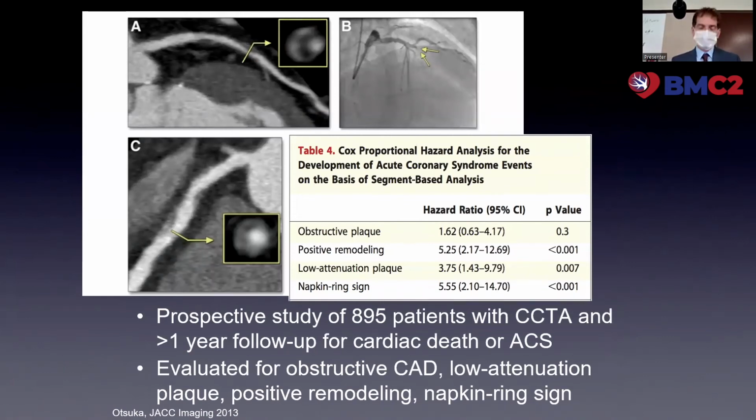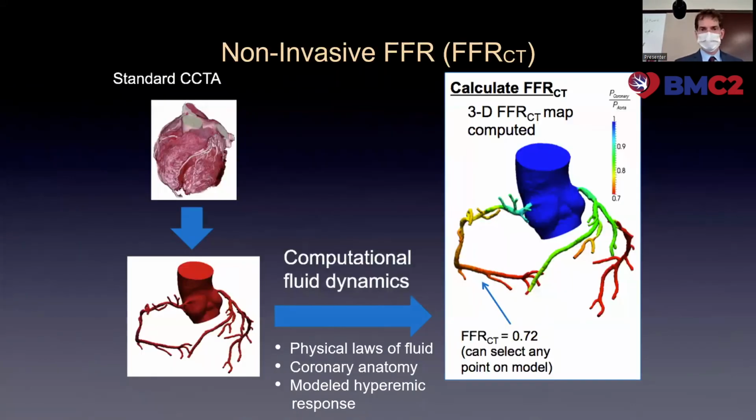So now I want to just move on and talk about some other areas, and I just have a couple slides left. I want to talk about a few areas that are of interest, future directions of coronary CT. There's a lot of interest in looking at high-risk plaque features, people that might, if we see something on CT, represent a future acute coronary syndrome or something that could lead to plaque rupture and MI or death. There are several findings on CT that can be helpful with that. I'm not going to go into detail.